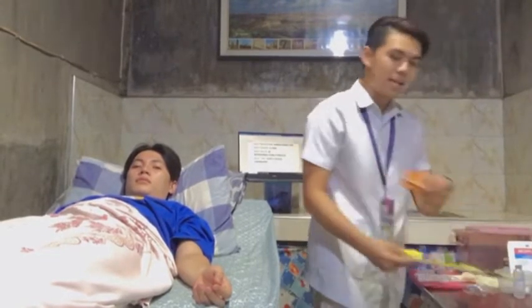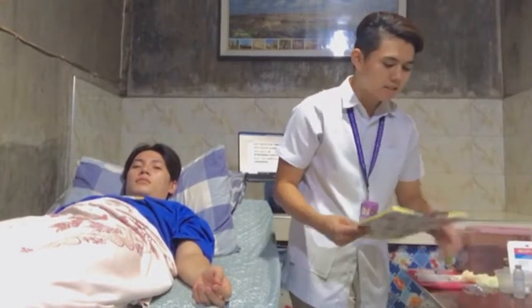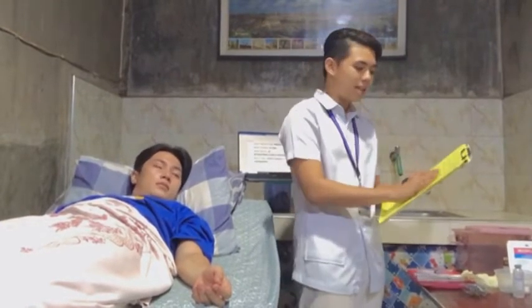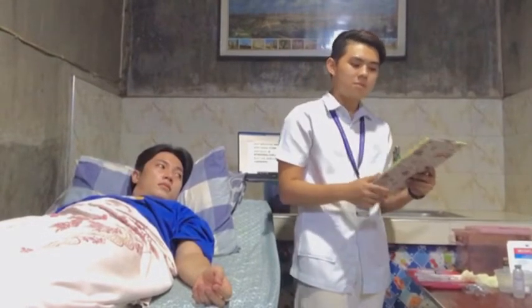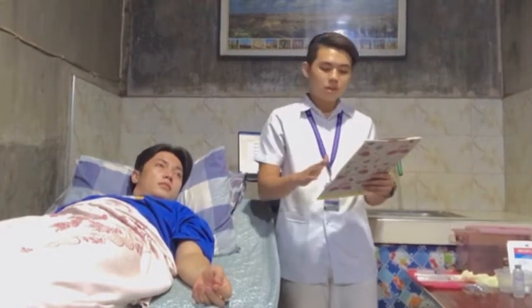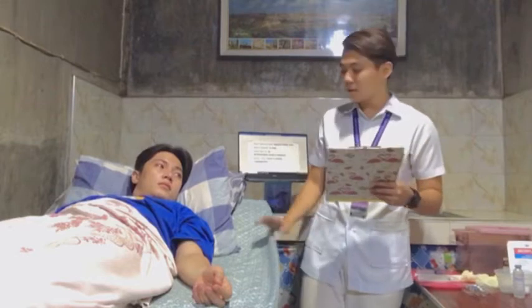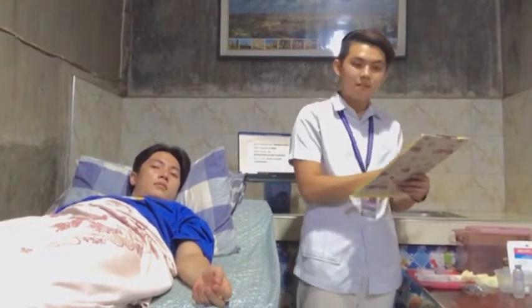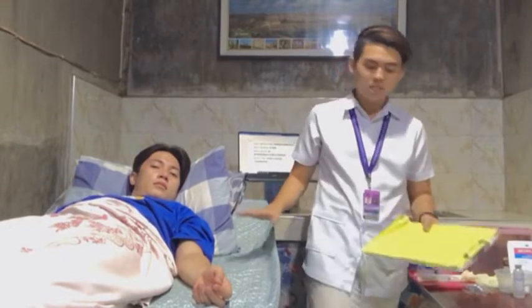So I have the medication tickets here, and as I can see here, the doctor's order on the yellow sheet aforementioned that the patient has a moderate fever and his temperature that was taken 3 minutes ago by another nurse is 37.9 degrees Celsius. So we will be giving intradermal injection for our patients today.